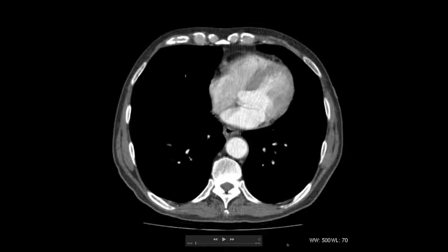Okay, so I'm here today with Dr. Pete Thurley, who's a consultant radiologist at the Royal Derby Hospital, and we're going to talk today about interpretation of the abdominal CT scan. So welcome, Pete, thanks for coming.